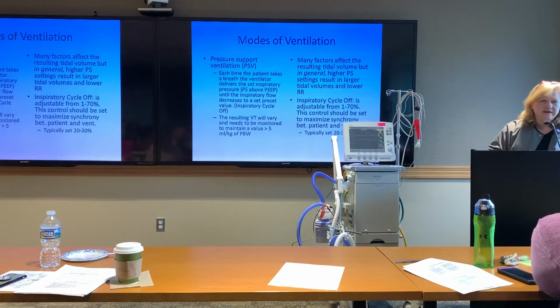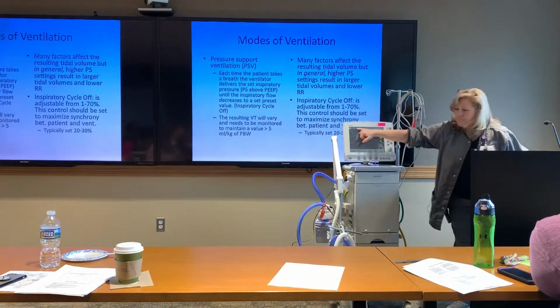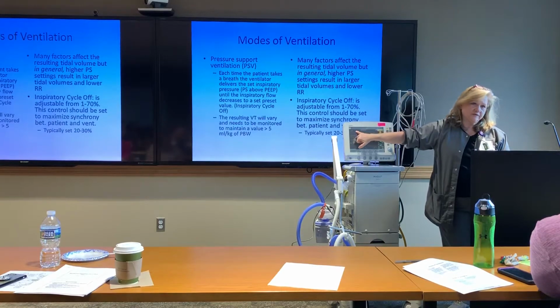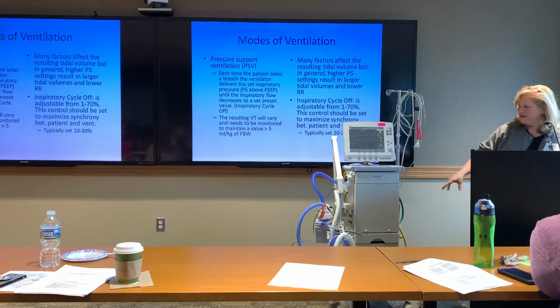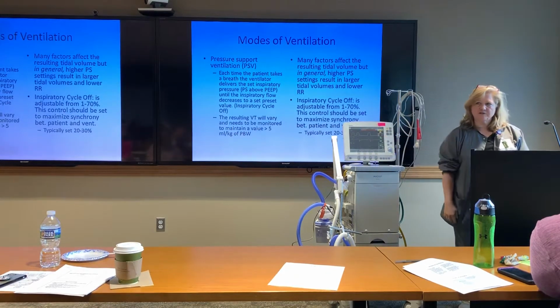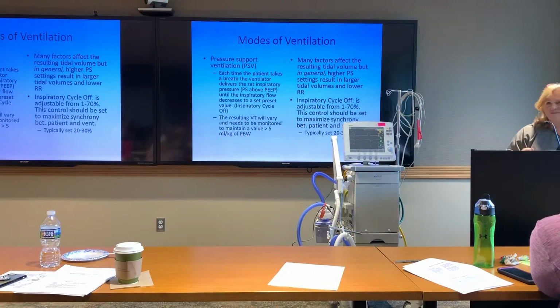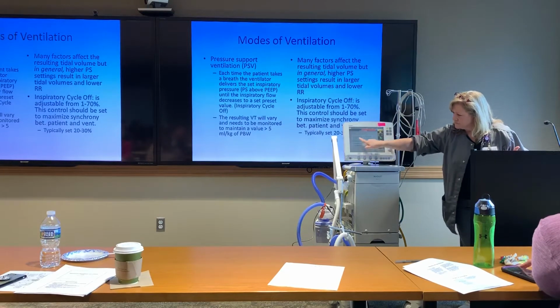I've seen it documented. So I have the spontaneous breathing trial going. I come in and I see what I see, and I go, okay, no spontaneous breathing trial is done because I'm in backup ventilation. It tells you right there as well. PS, backup, right? So it tells you on the screen. Also, if you're in pressure support, it looks like this, very suspicious. Nobody ever breathes like this on pressure support. Nice square equal waveform, okay? Just something to be aware of. And now I'm going back into an assist control mode.